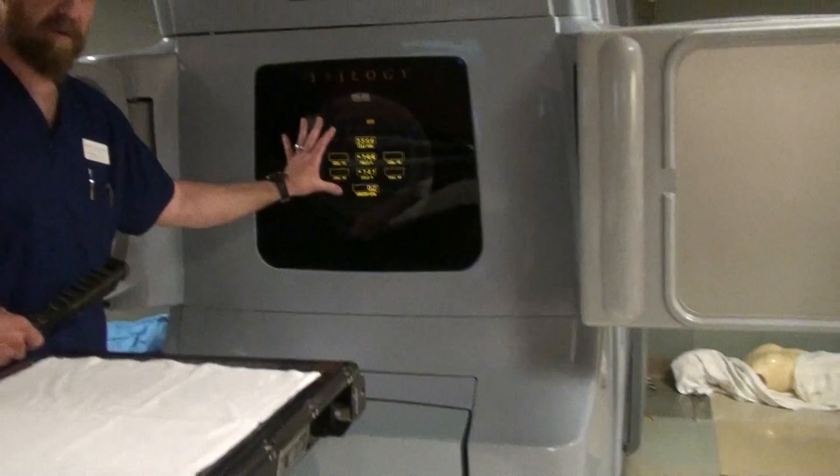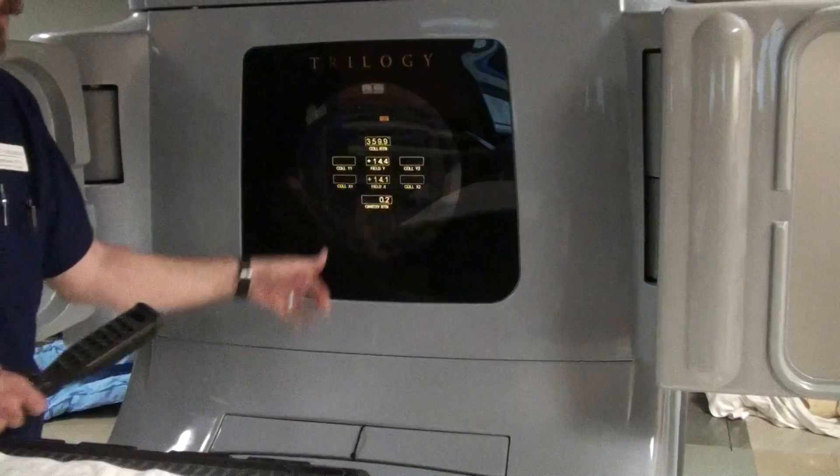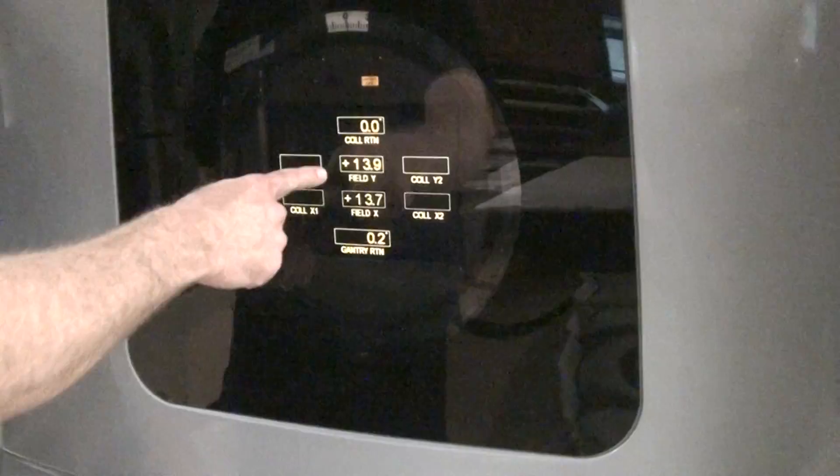The field size is also shown on what we call the readout on the gantry, sometimes called the pizza board. The X dimension is right there; the Y dimension is above it. It's kind of flip-flopped from what you would think — normally X by Y, width by length, but they have Y on top and X on bottom on a Varian unit.